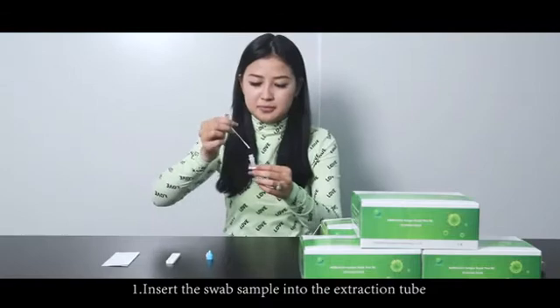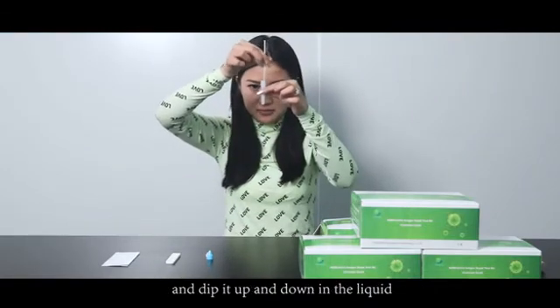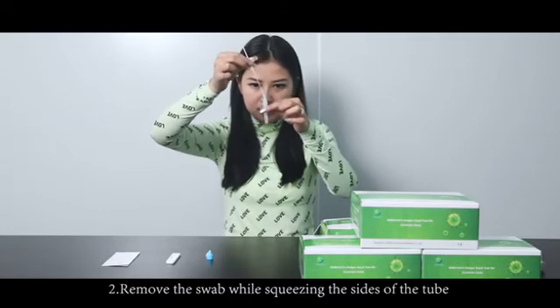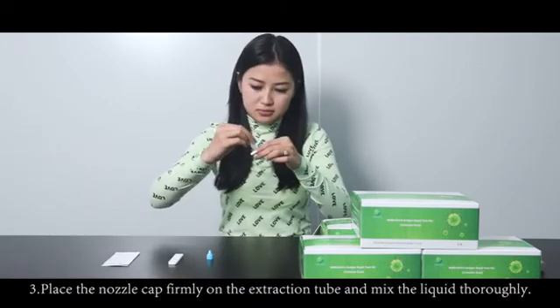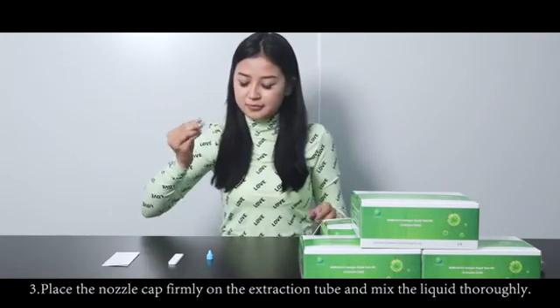Test performance. Step 1: Insert the swab sample into the extraction tube and dip it up and down in the liquid. Rotate the swab several times as you do this. Step 2: Remove the swab while squeezing the sides of the tube to squeeze the liquid out of the swab. Step 3: Place the nozzle cap firmly on the extraction tube and mix the liquid thoroughly.